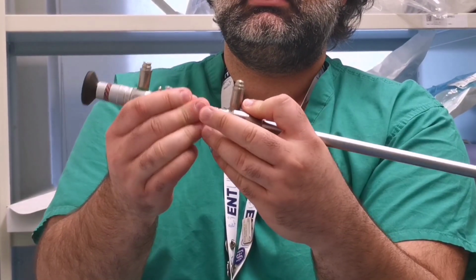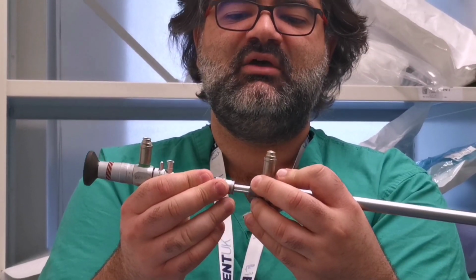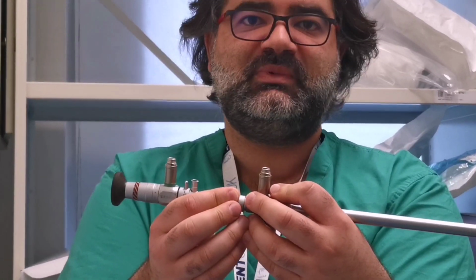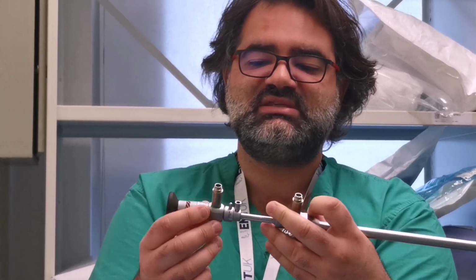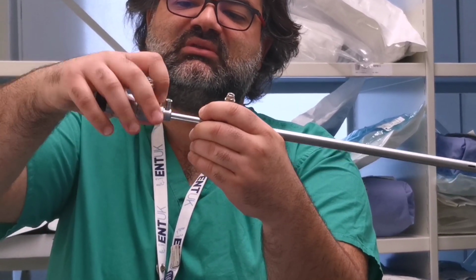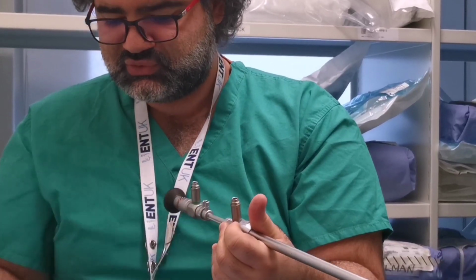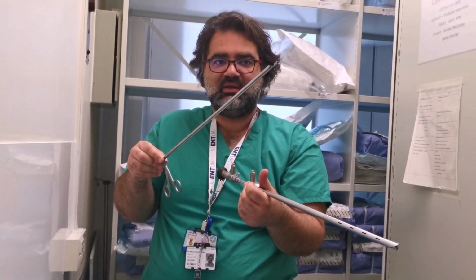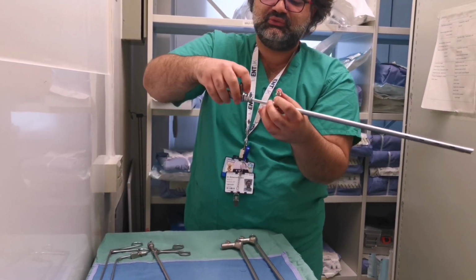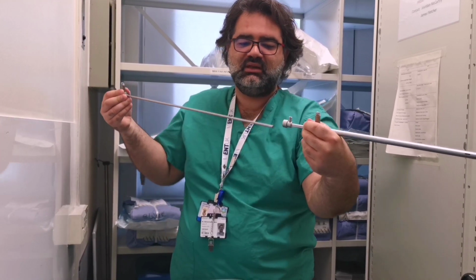So now, everything is locked from this end, okay? Still, you can remove everything from this kind of area when you need to switch to the fiber optic forceps, but everything is locked from this area. If you need to unlock it and remove your lens, you just put this on a lateral position and it slides, okay? Now if we need to switch to the optical forceps, what we need to do is first unlock the lens, because we need it to go into the light forceps.